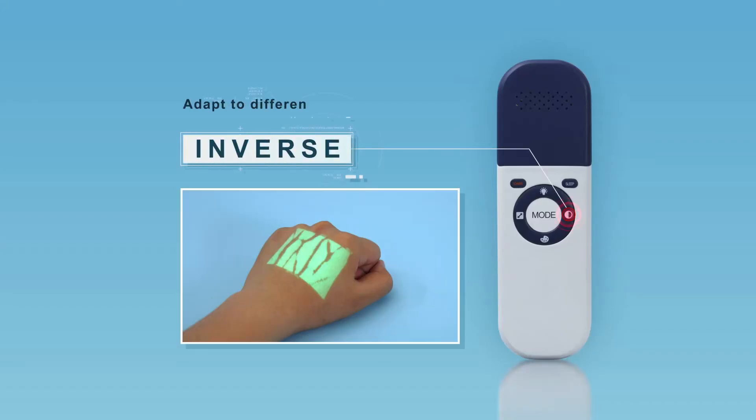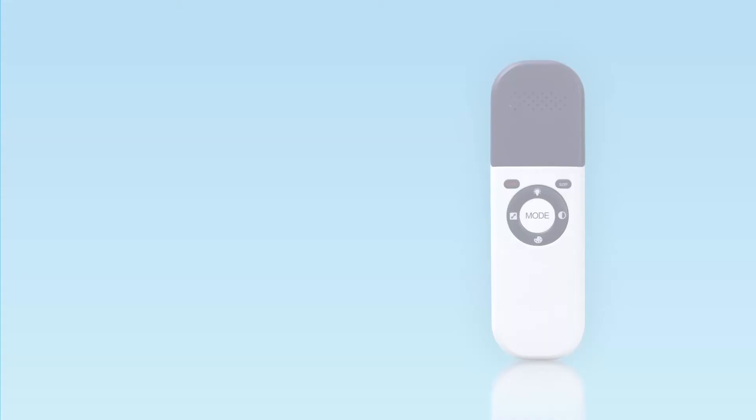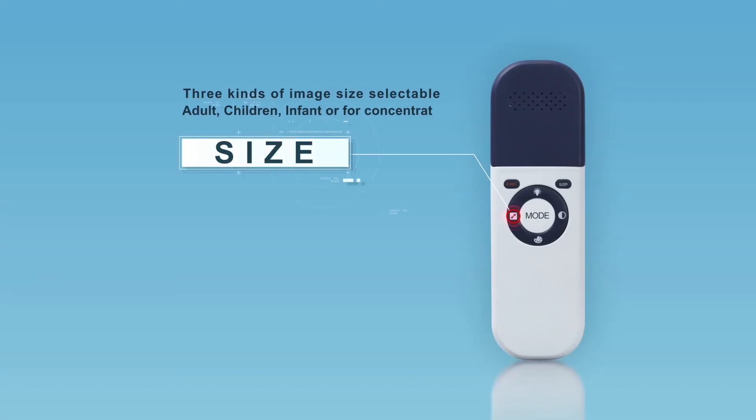Inverse mode helps the device adapt to different skin conditions and medical staff preferences. Short press the inverse button to invert the image.